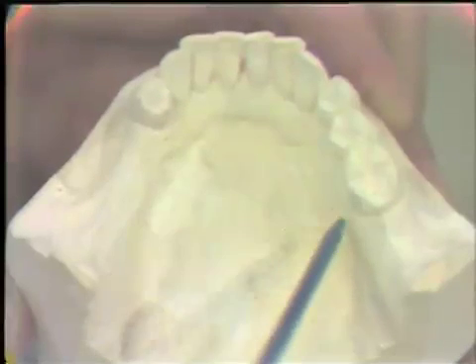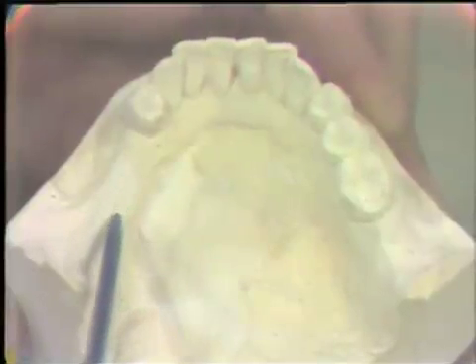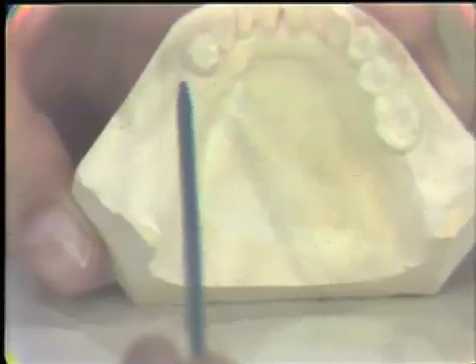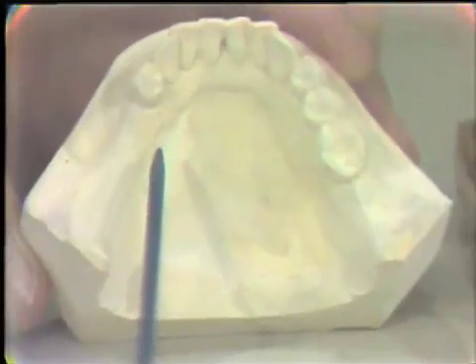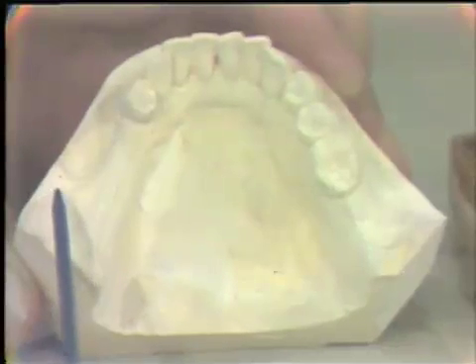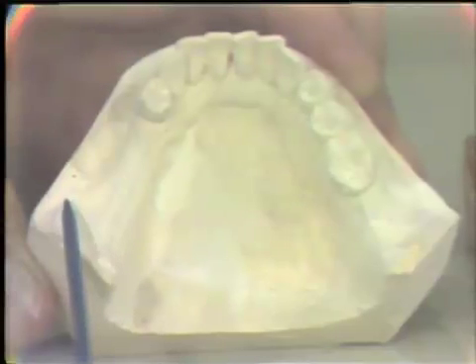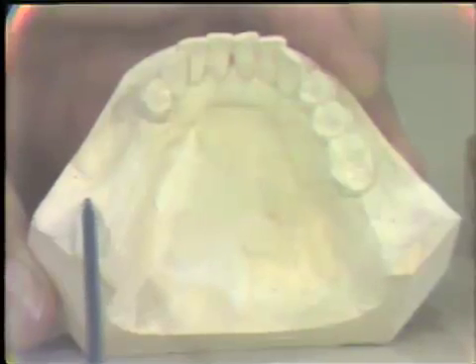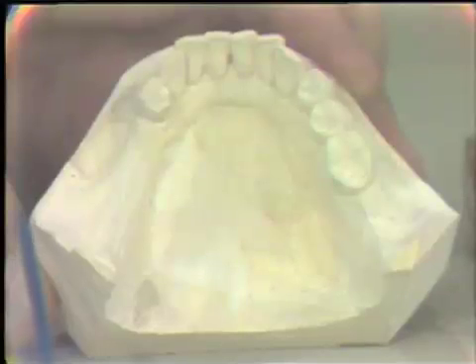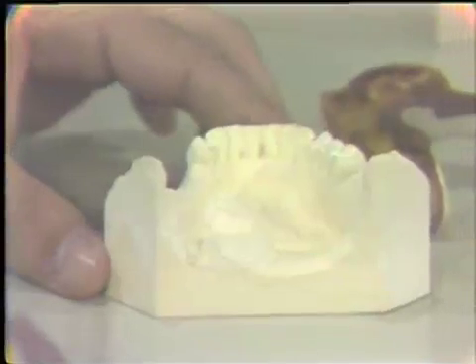The lingual area is very critical because we need to see whether there are any undercuts in that soft tissue, and we need a good impression of the edentulous area. We realize that an alginate impression will distort and, because of its consistency, will probably give you an overextended diagnostic cast. So we do not depend on it for the final peripheral role of the appliance, but we would like to get an adequate registration for diagnostic procedures. We will now go to the patient to secure the alginate impression for the diagnostic cast.